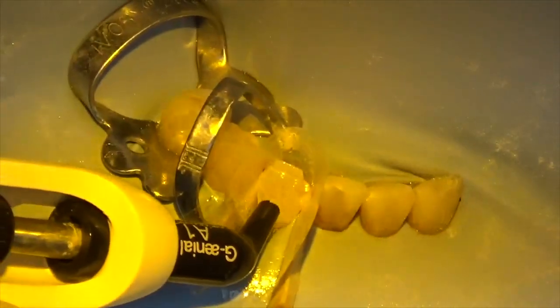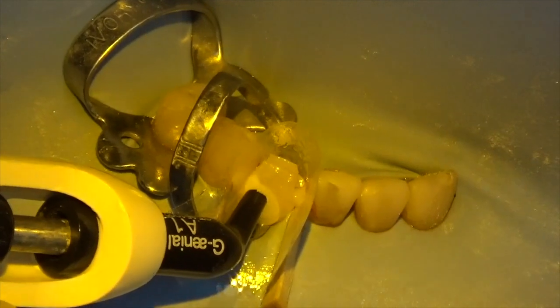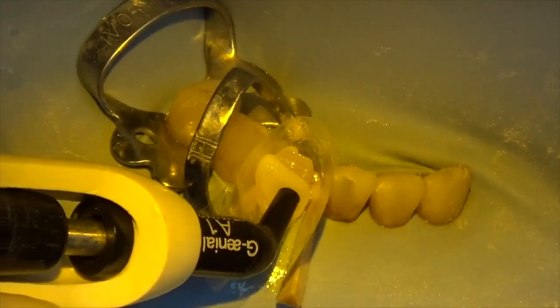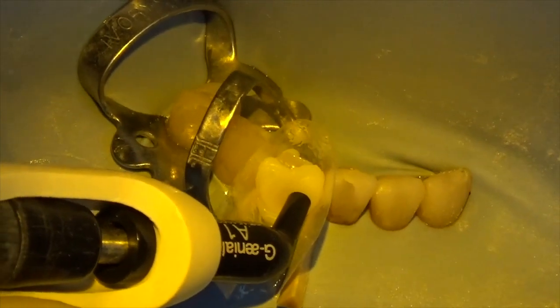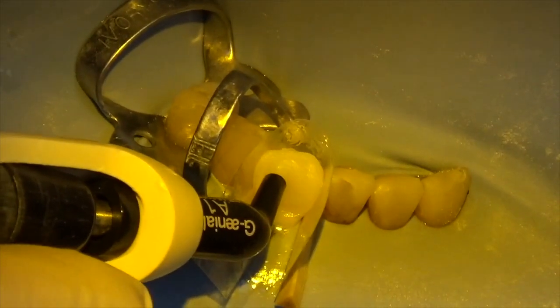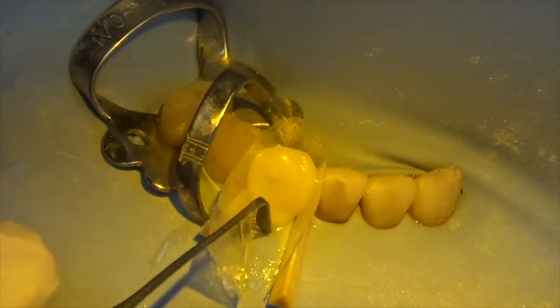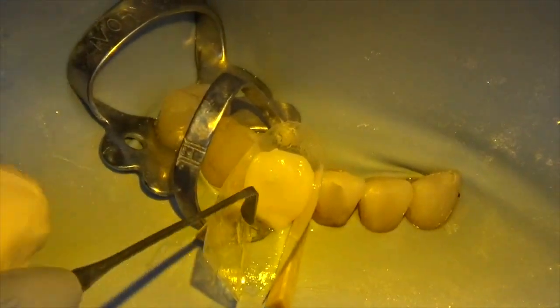I put a little time to drop a flowable on and cured it with the bonding agent. Then I've gone back and put a little bit more flowable, left it wet or uncured, and now I'm injecting composite resin.